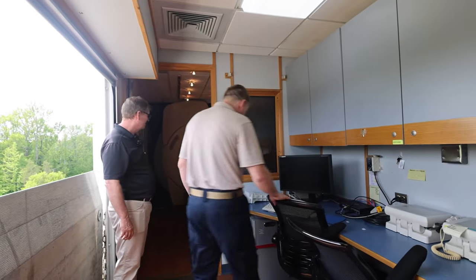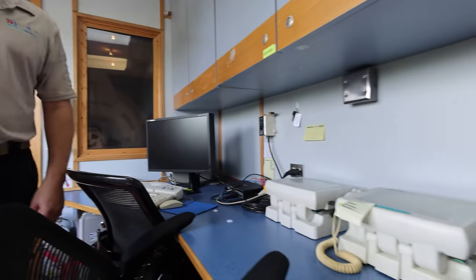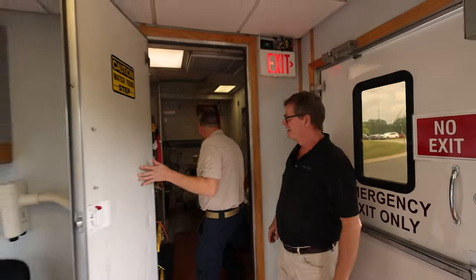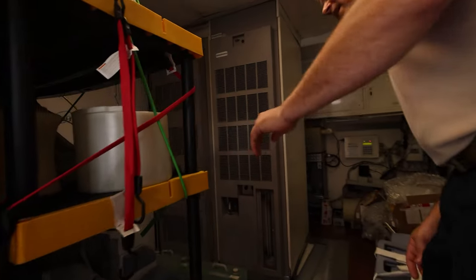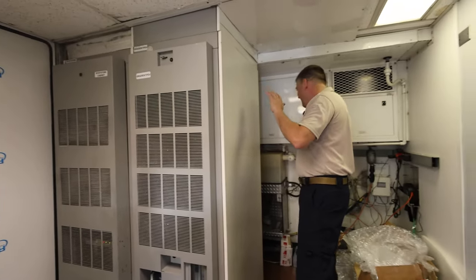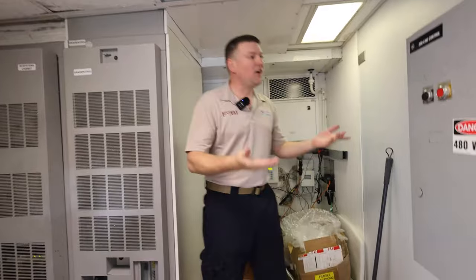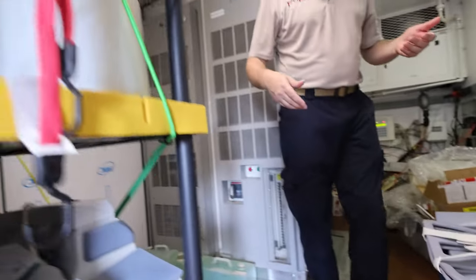That's very cool. All right, so we have our console right here. Medrad injectors, everything I would expect. Right back here, if we can flip around a little bit, make sure the light's on. This is where the equipment room is. This is where the cabinets are. Oh, cool. I want to see these. It's a little bit loud in here, guys. I hope that you can hear me. But we've got some phantoms, all the coils. We've got extra coils. Oh, it's so cold in here. This is awesome. Oh, I'm being blasted. They have a huge AC chiller on the front of this trailer. I got some more coils, our emergency shutoffs. This is actually more convenient than I see in some installs and facilities.